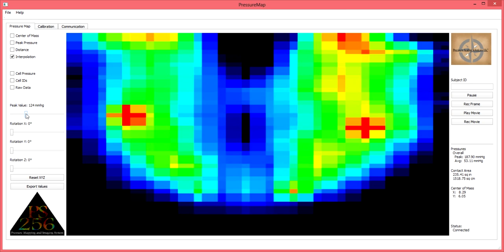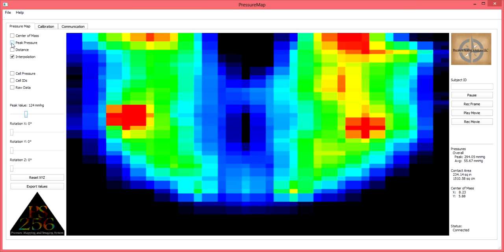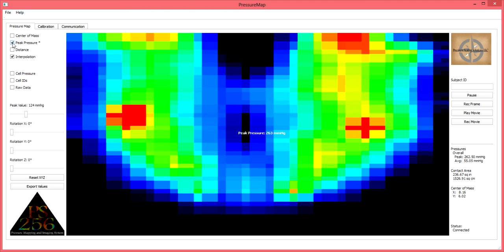To identify the specific amount of pressure which is being exerted on any portion of the mat, move your cursor to the upper left-hand side of the software screen and select the peak pressure feature as you see here.